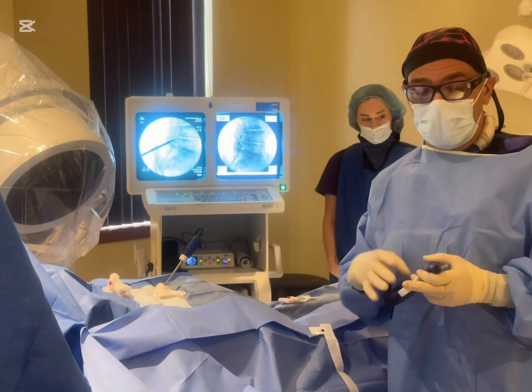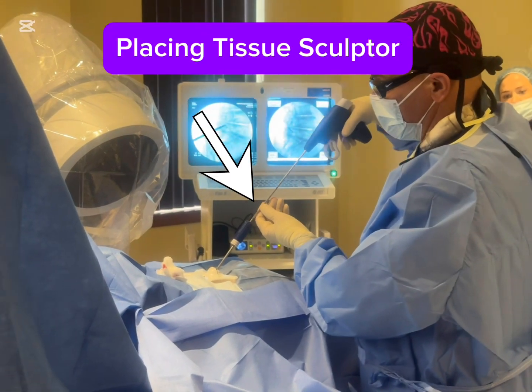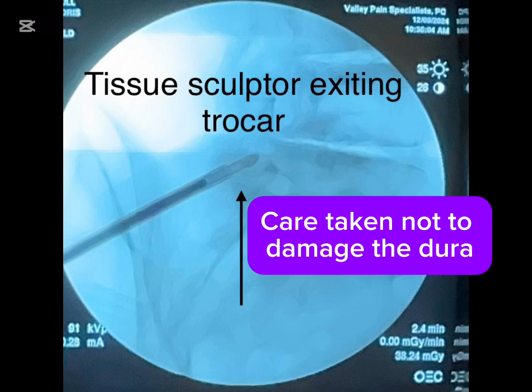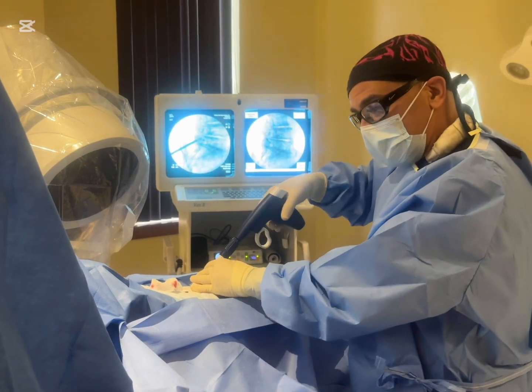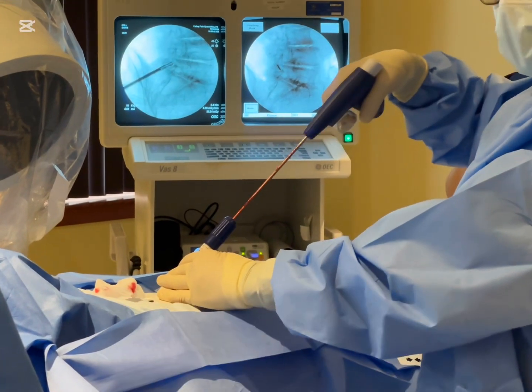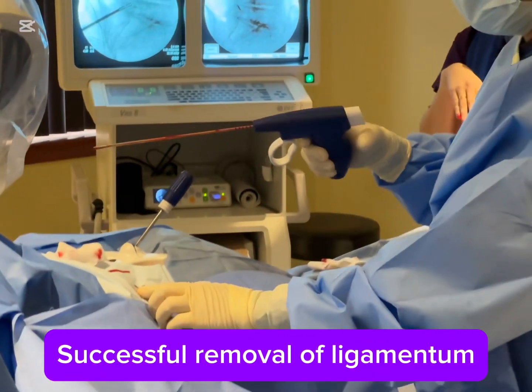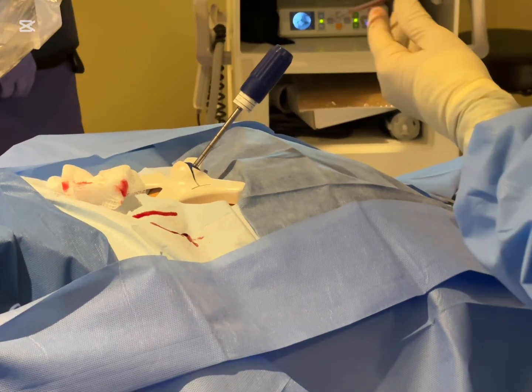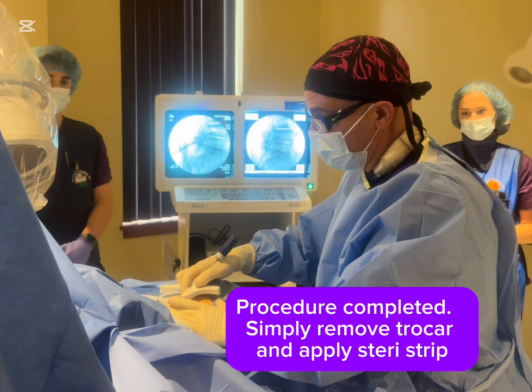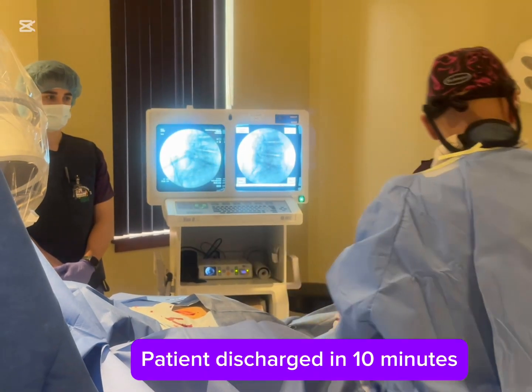Now we're going to place the proprietary tissue sculptor device in through the trocar and try to get out some of the ligamentum flavum. We make a little rocking motion here to try to cut the ligamentum flavum with the sharp end of the spoon-like device, pinch it, and then try to remove the ligamentum flavum and push it off — and there it is right there. That's part of the ligamentum flavum tissue which was giving her some stenosis. We completed the procedure and simply removed the trocar and stabilizing device, which is one unit. Tiny little hole — put a Steri-Strip on there and that's the end of the treatment.